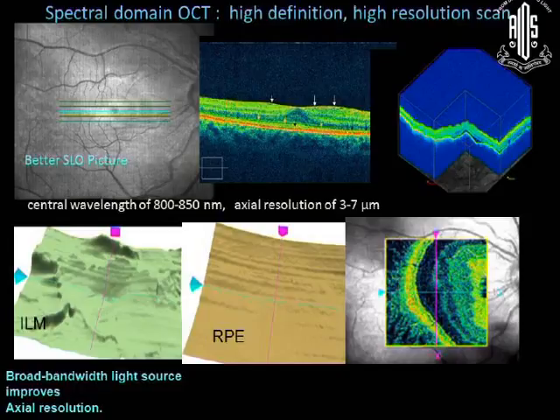Eye is like an onion. So if you make the onion rings, you slice it like this. If you slice it like this, you will see individual layers of the retina like this. This is called en-face OCT, and you have the facility to superimpose it on your fundus photograph and sometimes even on fluorescein angiography to correlate what is happening on OCT with what we are seeing clinically.